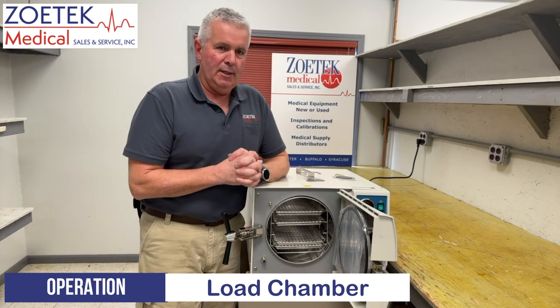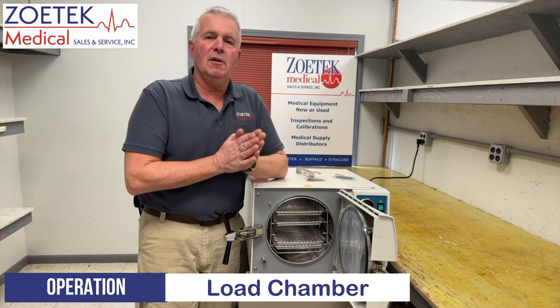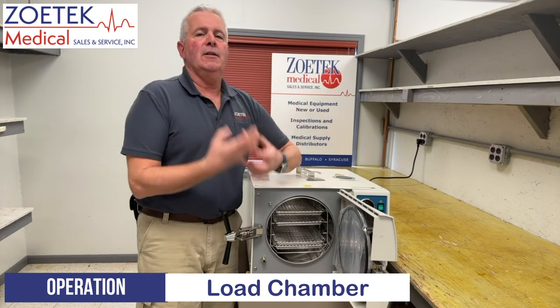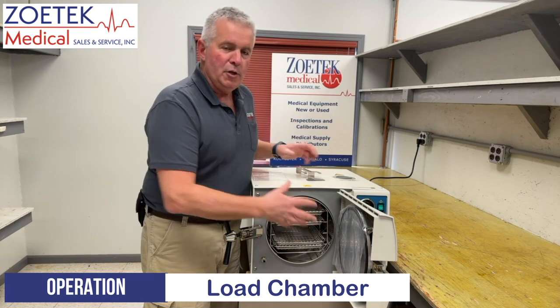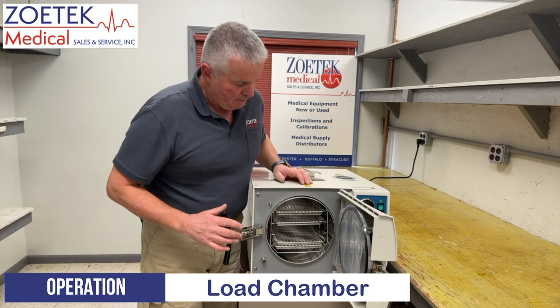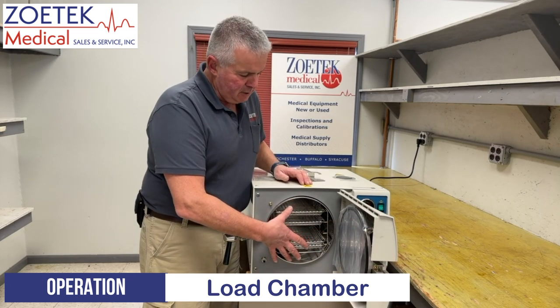Always recommend that when you put stuff in there, don't pack them tightly. Tightly packed items in the sterilizer don't sterilize well. You want the steam to be able to surround and get to all sides of whatever you're sterilizing to get good sterilization. Make sure you don't pack it full or stack items on top of each other too tightly.